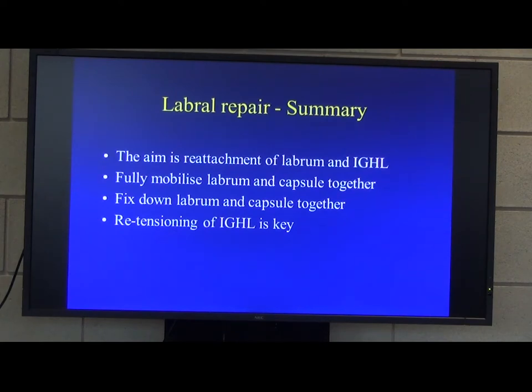Question: Are you refreshing the bone surface on the glenoid with a shaver? I tend to use a rasp, just with a rasp — not using a shaver. But you can use a shaver as well.